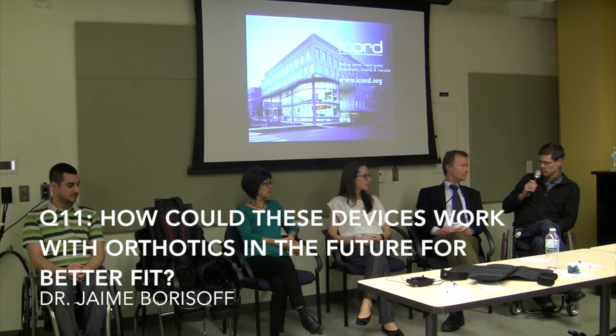So I believe the Indigo has an ankle orthosis, and the ReWalk does too now, I believe. More of an orthosis. It's a foot plate. It's a foot, okay. Yeah. And I also know the ReWalk institutional model is fully adjustable through a lot of sizes, but the personal model is customized to the individual. So that's starting to get at that kind of personal orthosis, designed from the factory for the person, and hopefully that'll help some of these skin issues that you and others are seeing. I suspect they will start moving that way, more as they get into individual use models as opposed to ones for a research center that you can set up for many different size people.